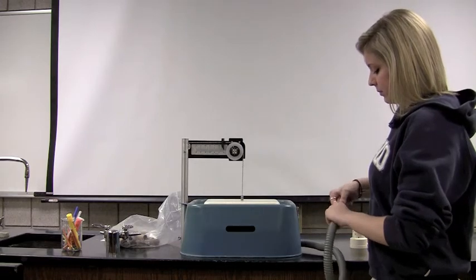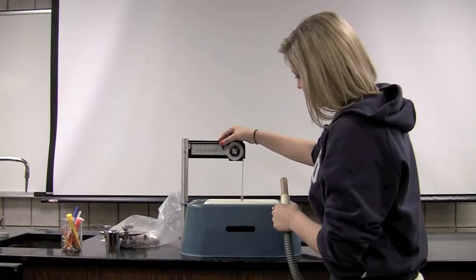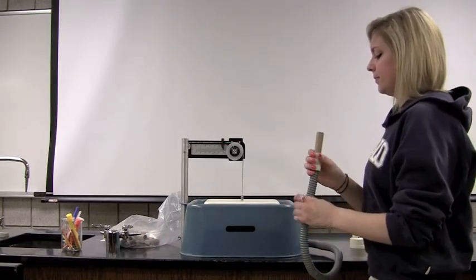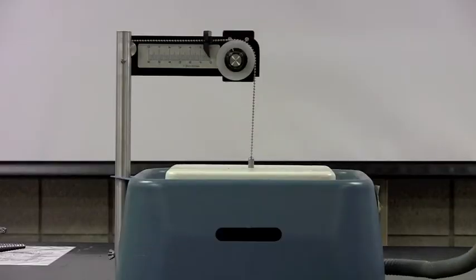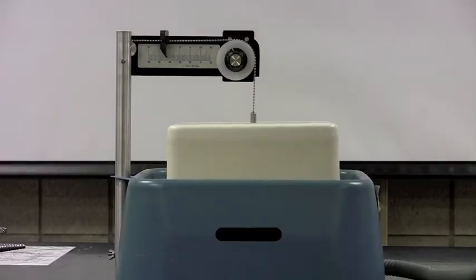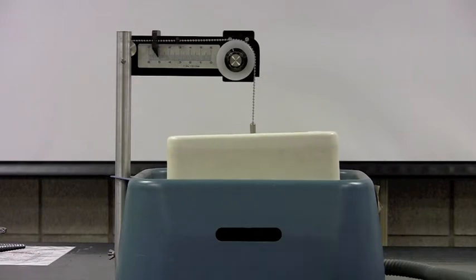This device has two chambers. One is filled with water, and the other is an inverted bell suspended in the water. When the subject exhales air, it enters the water-filled chamber and causes displacement of the smaller air-filled inverted bell. The amount of movement of the chamber is used to measure the amount of air.